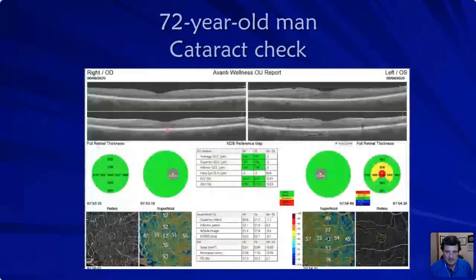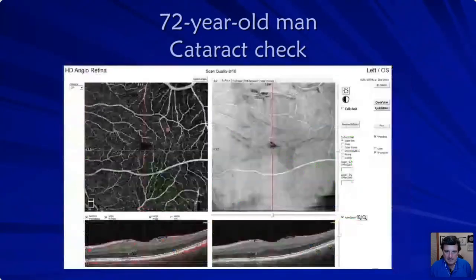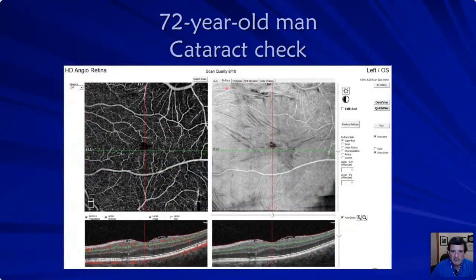So let's take a look at this epiretinal membrane. This is the en face right here. I've clicked on this button, and we're looking at the en face. You could just see all the wrinkles that are occurring. You could see the epiretinal membrane here. And patients love this. I show them, look how large this cellophane maculopathy, as we call it, or this epiretinal membrane that has grown across the surface. Look how large it is. And it's not really creating too much distortion to the vasculature.